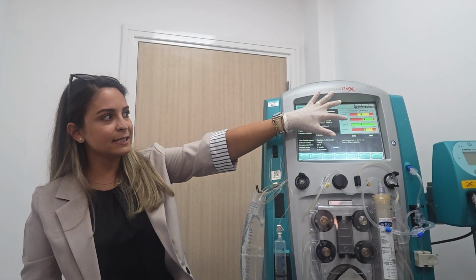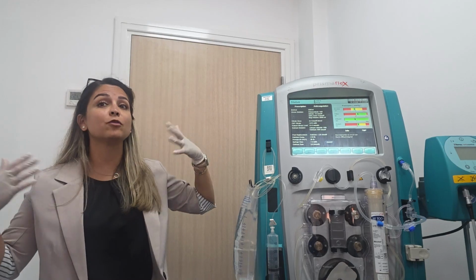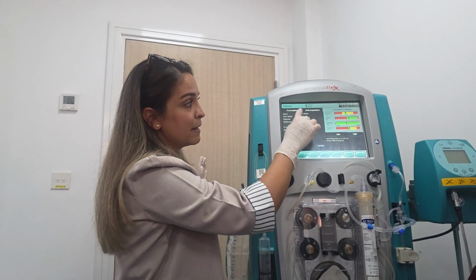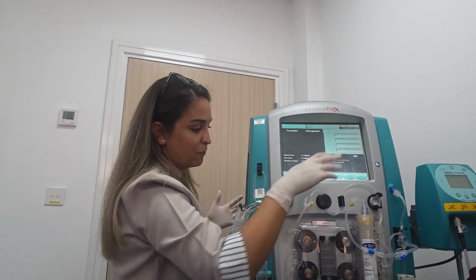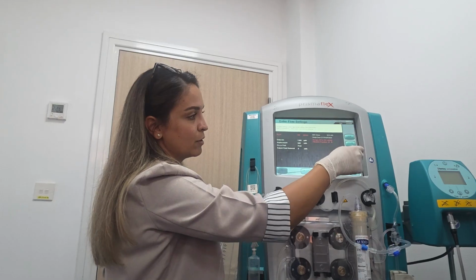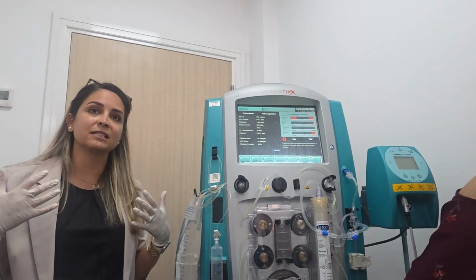If you see access and return below 100, it means the flow rate from the catheter is very good. And look, right now I am at maximum blood flow, which is 130. If I made it higher, 150 for example, forget the citrate, I'm just talking in general. If we made it 160, for example, it will increase the pressure on the catheter. Okay?